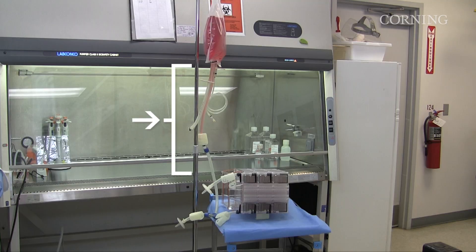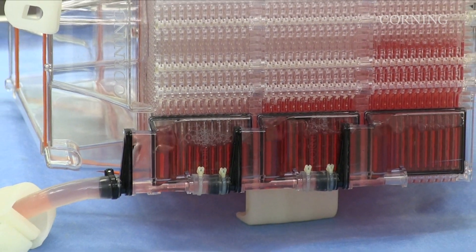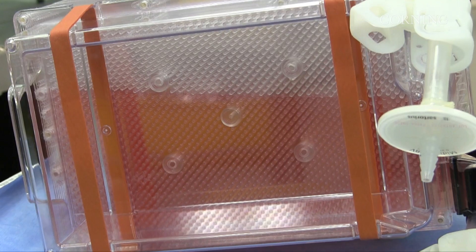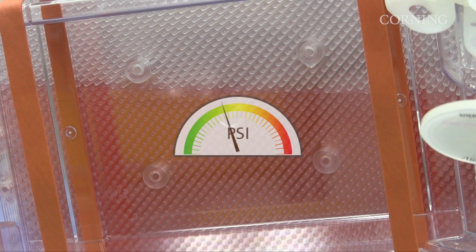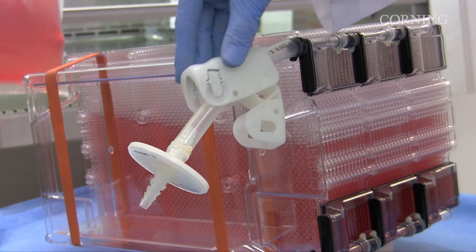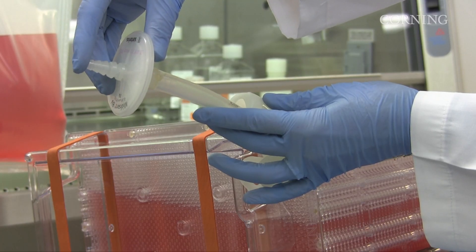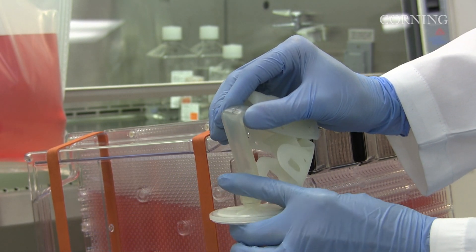To prevent the vent filter from wetting out, be careful not to raise the source vessel too high, which will fill the vessel too quickly. A wet filter prevents air from leaving the Hyperstack vessel, which pressurizes the vessel and increases the risk of vessel failure. Keep the air vent tubing clamp open during filling — closing it will cause the vessel to overfill, pressurize, and possibly fail. Obstructing the airflow from the vent or bending the tubing can also increase internal pressure and cause the vessel to fail.